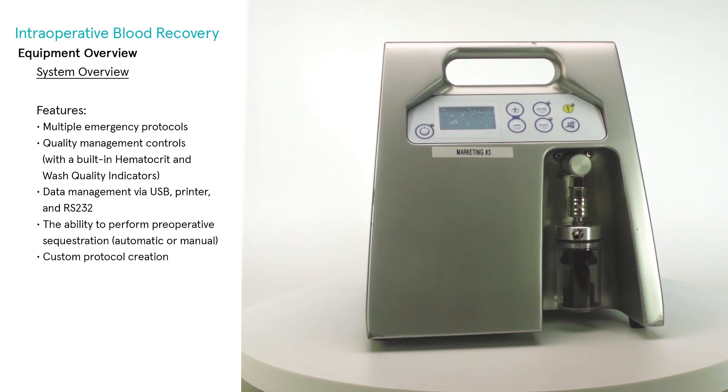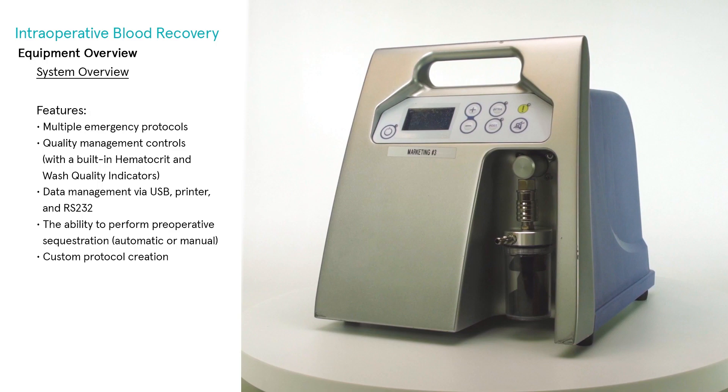The Extra auto-transfusion machine is complemented with a modular vacuum system, the X-VAC. This system includes both an intra-op pump and a post-op pump.